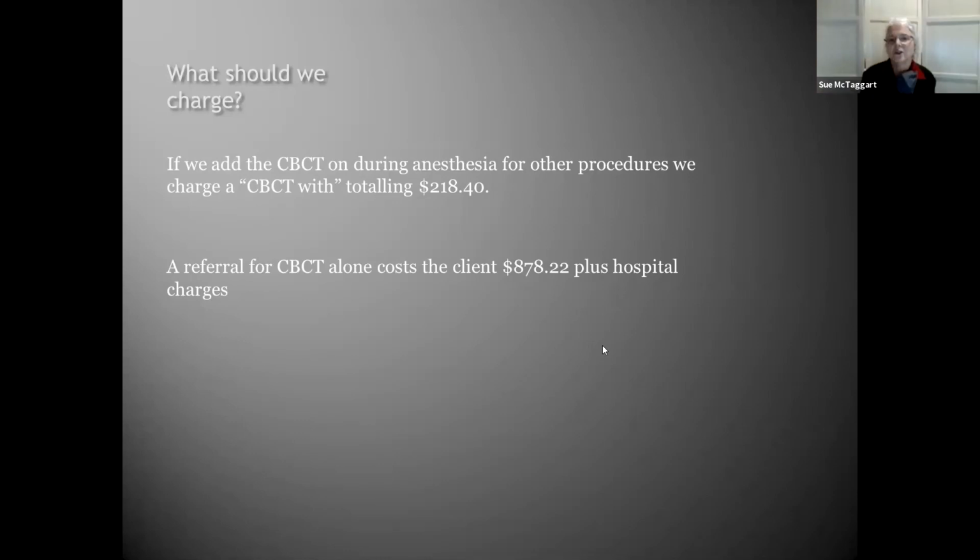Okay, that's a really good question. Definitely for rabbits. I don't know how many of you do rabbits, but for rabbits, I do a scan every single time they come in. And I don't even take two-dimensional x-rays anymore at all, because their whole face is like a maxilla, really. So those get repeats all the time. If I see a pathology and I want to know if it's healing, I will always do a repeat. And I also will take a scan, I did an ear flush.